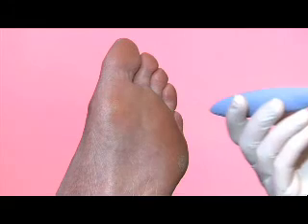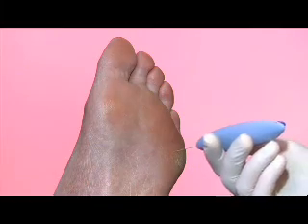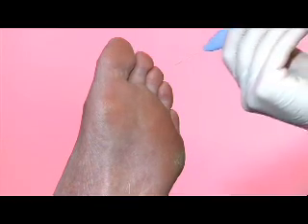Avoid testing areas on the foot where there is callus present, areas of ulceration or scar tissue. You may have to test proximally or distally when any of these are present. Do not make any repetitive contact or allow the monofilament to slide across the skin.